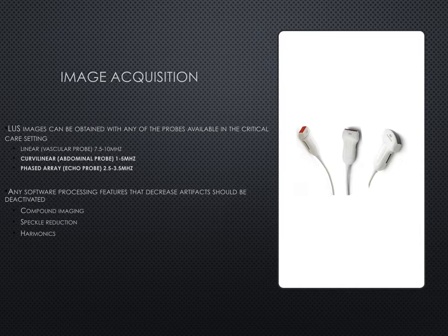The curvilinear probe is a little bit more versatile in its imaging capability from the lung perspective. We can use it the same way that we would use a linear probe for looking at the really superficial structures, but it also gives us that frequency so that we can see some of the deeper structures if we're looking to identify consolidations or pleural effusions within the lung itself.